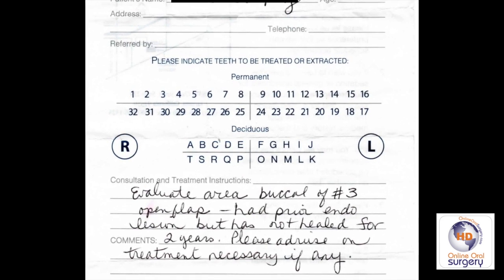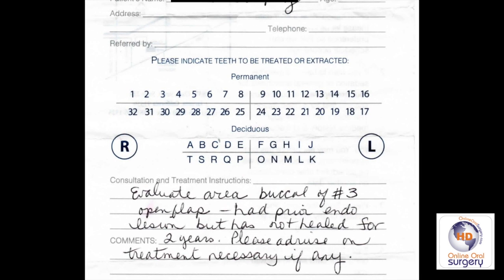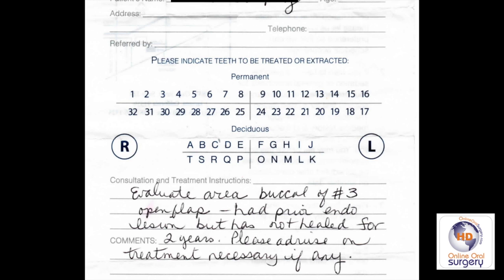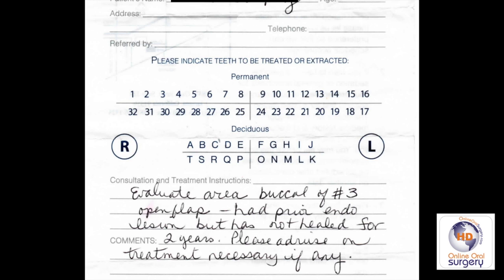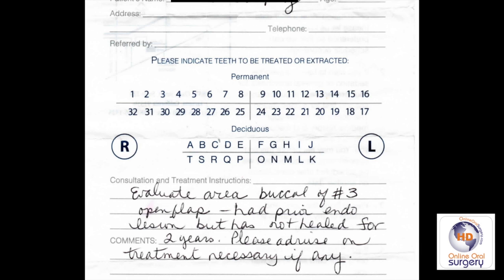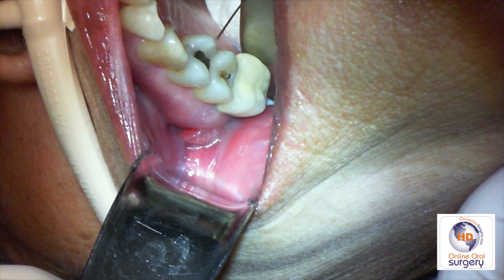The patient had prior root canal therapy because of an endodontic lesion two years ago, but the lesion has failed to heal and this apparent open flap has developed. The dentist would like me to evaluate and advise on the necessary treatment, if any.